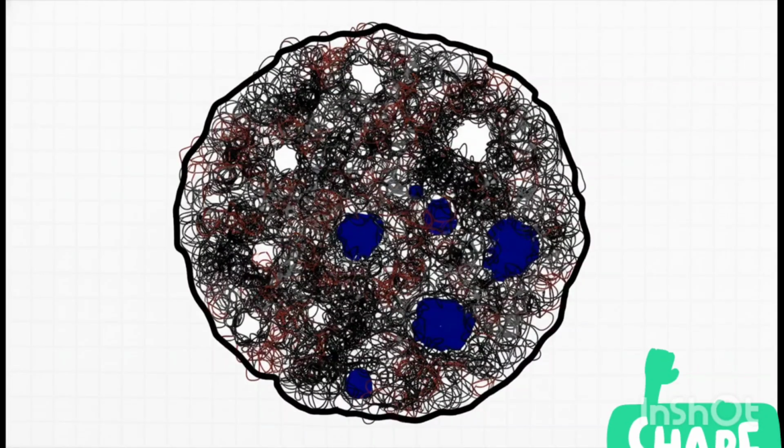On the flip side, what happens if the fibroid outgrows its blood supply? Well, the tissue actually breaks down. This is a degenerating fibroid. It loses that solid, uniform look entirely. Instead, it becomes heterogeneous, taking on a mixed, almost sponge-like or Swiss cheese look, riddled with dark, fluid-filled cystic spaces caused by the dying tissue. It's a totally different picture.